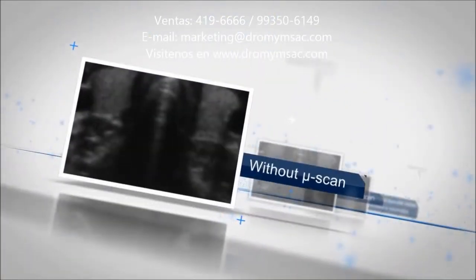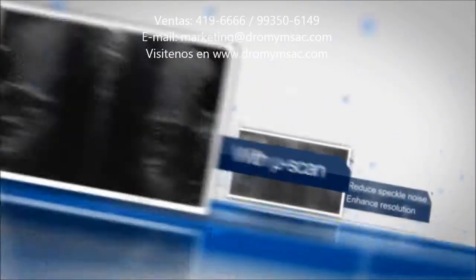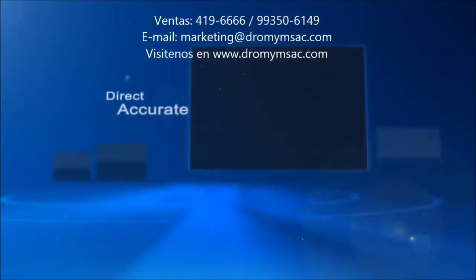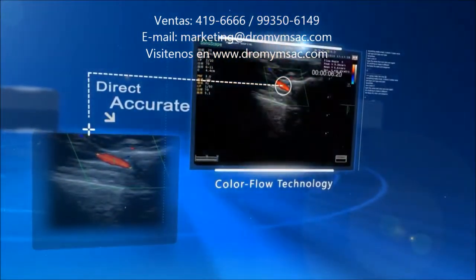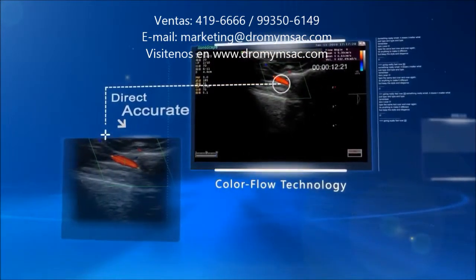S20 is configured with the Sonoscape MuScan imaging technology. It can clearly visualize tissue boundaries, reduce speckle noises, and increase both spatial and contrast resolution. Sonoscape Color Flow Profile Technology offers an innovative way to calculate blood flow volume in color mode, saving the time of tracing spectrographs.